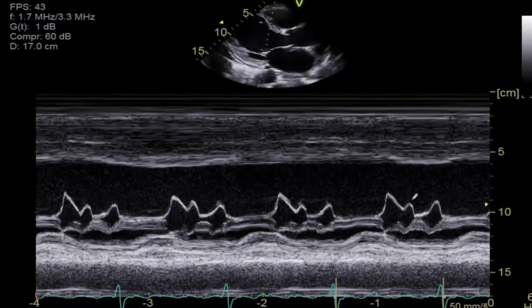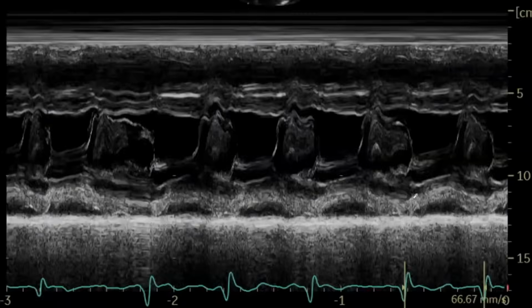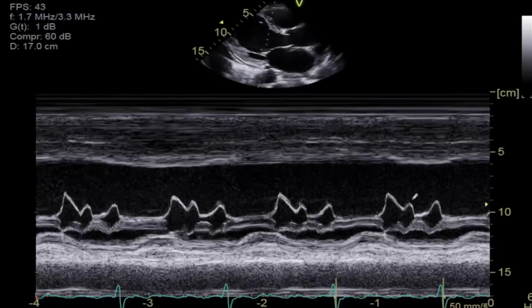Okay, and I have seen a couple of patients who have it like that, and you will see it like this. You can be the first to diagnose those patients. I have seen a couple who were seen, had the echo, went home, and then we discovered by echo that they have atrial fibrillation, atrial flutter, 2-to-1 AV block, that was not diagnosed. So we are one step ahead of EP in this matter.